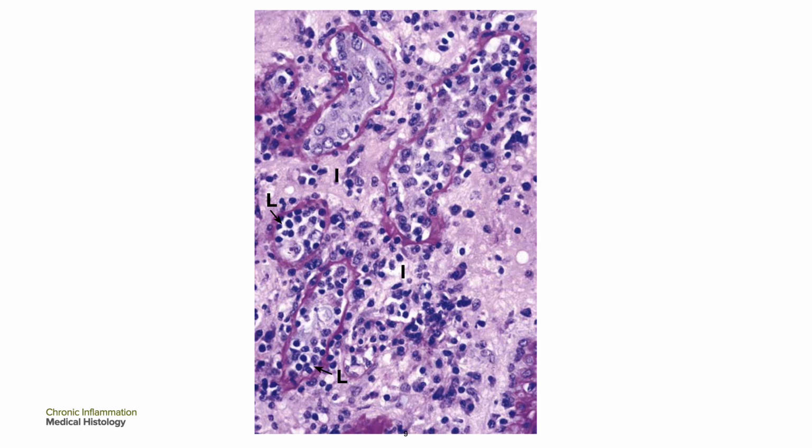In this image, there is an infiltrate of lymphocytes, most of which are T cells, in the interstitium, or letter I, of your kidney. The tubules are atrophic and widely separated. Your L, or lymphocytes, can be seen within the tubular basement membrane between the tubular epithelial cells. We call it tubulitis.